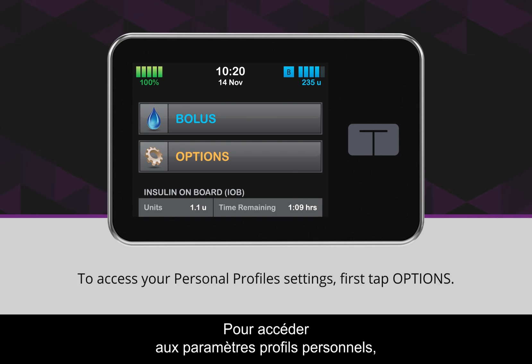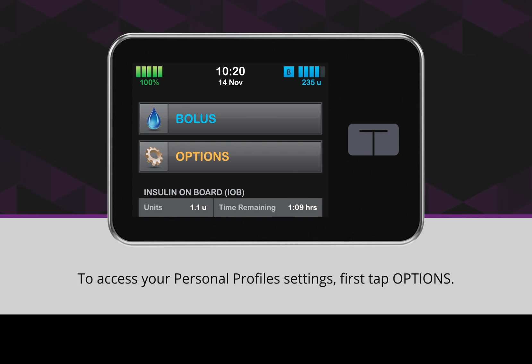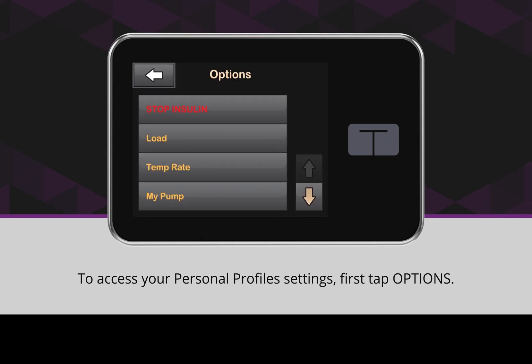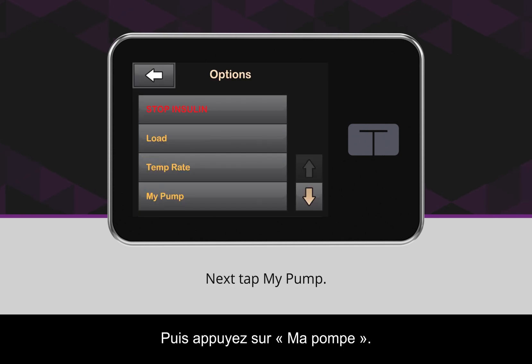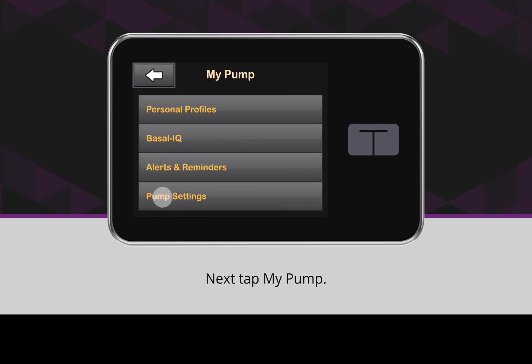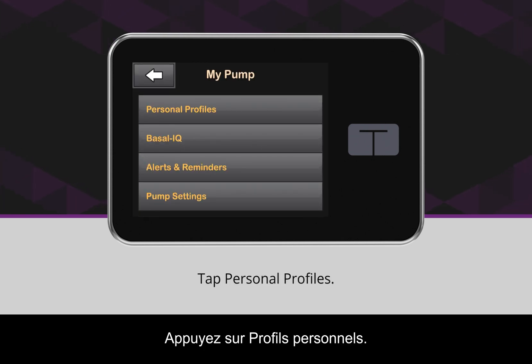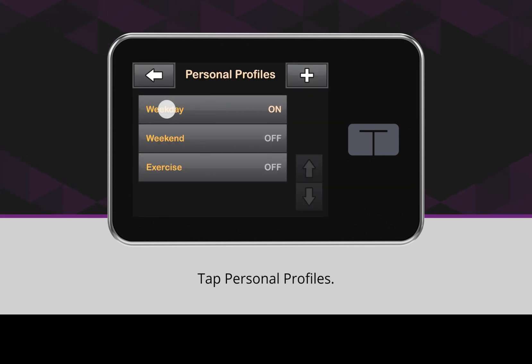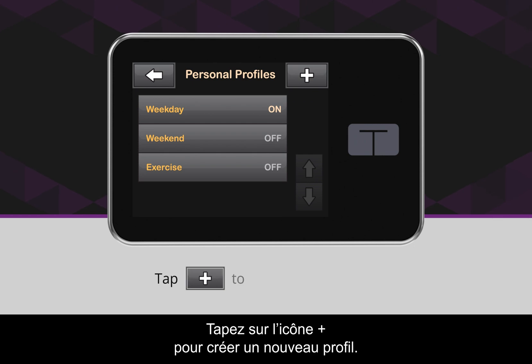To access your personal profile settings, first tap Options. Next, tap My Pump. Tap Personal Profiles. Tap the plus icon to create a new profile.